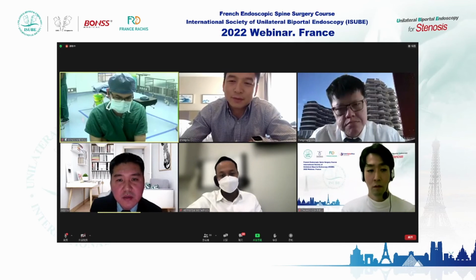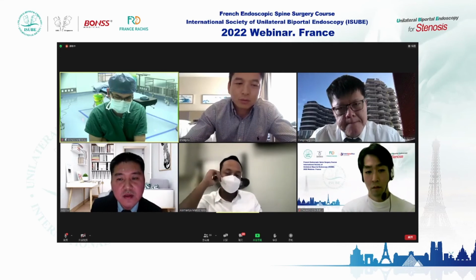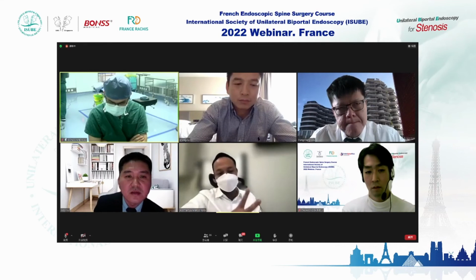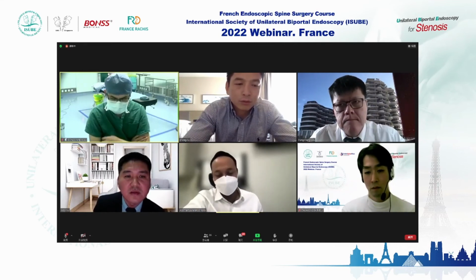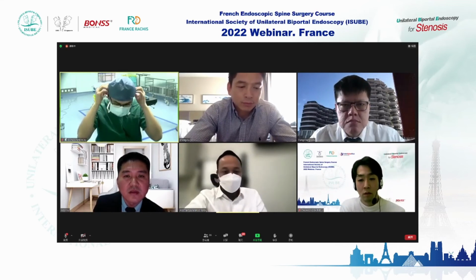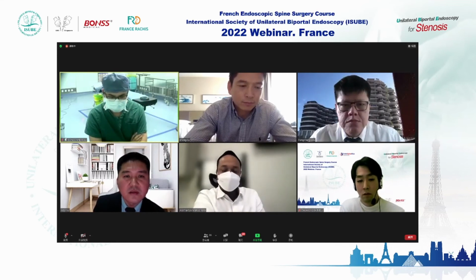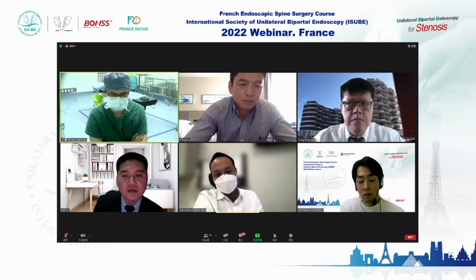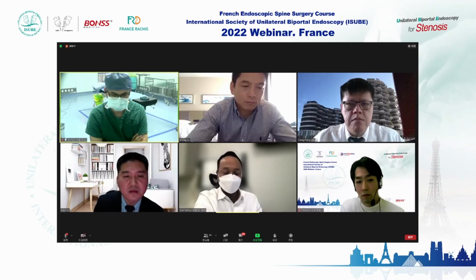How about Dr. Muhammad? Yeah. For your early cases, there are two types you want to see. First, the herniation type, and second, the stenosis type. For herniation, find a patient with a simple L5S1 disc herniation, with no downward or upward migration of the disc.